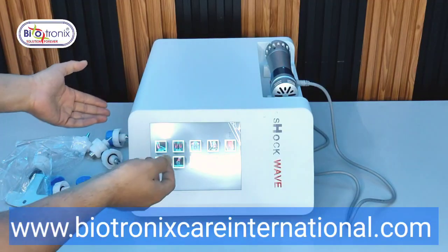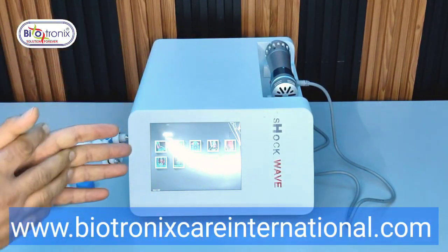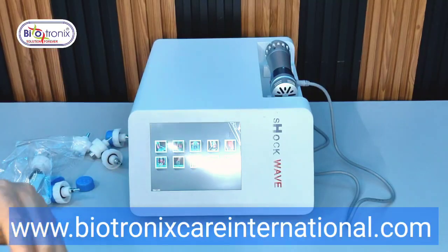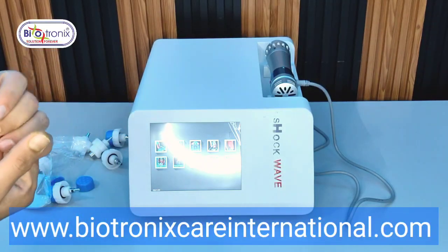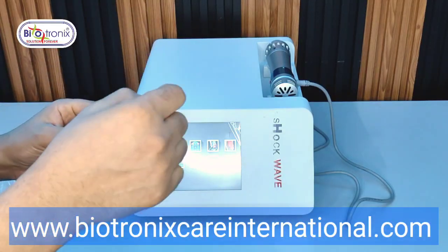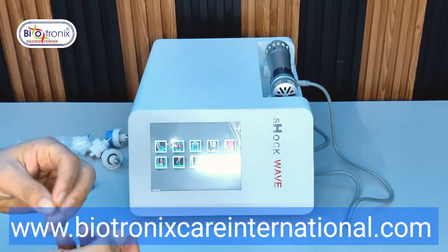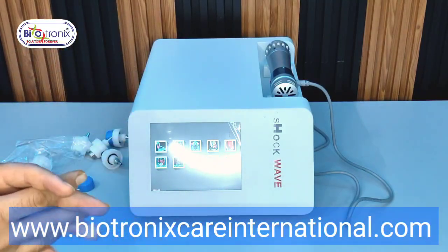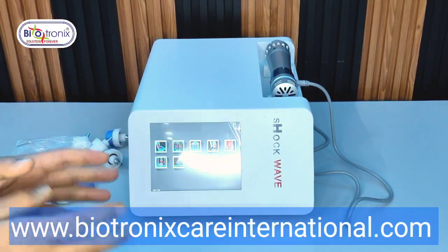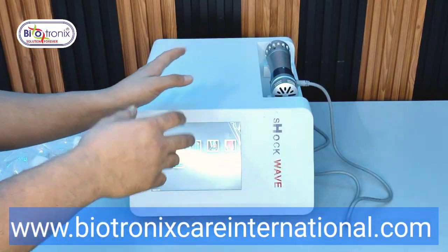And the bigger the area, the more maximum energy you can go. However, the energy variation the device will provide is from 5 millijoule to 200 millijoule, frequency 1 to 16 hertz, and pre-selection shots up to 5000. So this was the summary of the device. I think I have explained everything regarding this device.